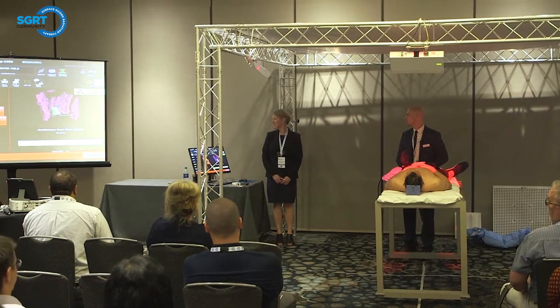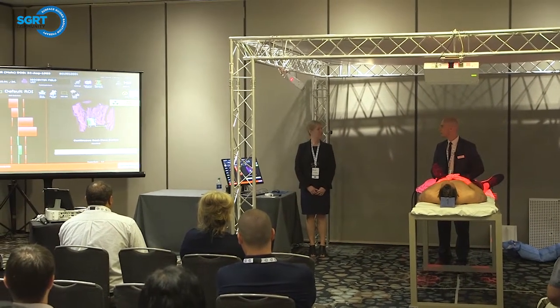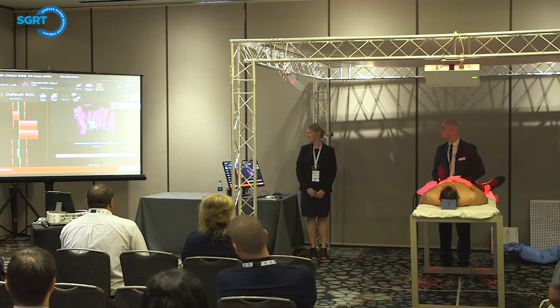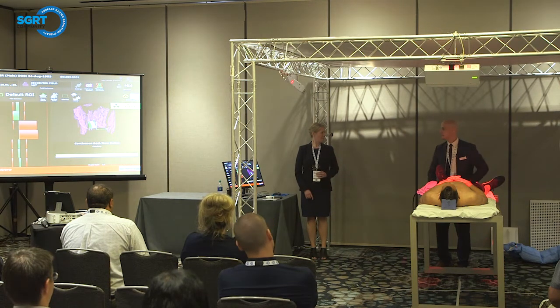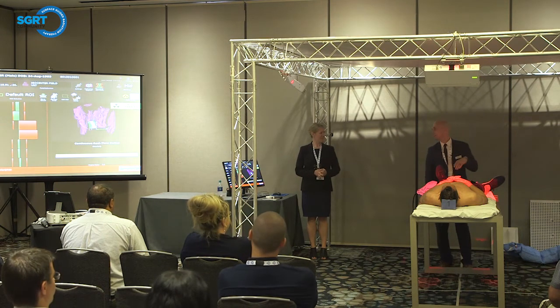Let's see, so I went the wrong way with the roll, so I'm going to rotate him out a little bit that way. Okay. Oh, come on. This is taking me too long here now. I got a little overzealous. Okay. Time? 32.49. 32, man, I'm getting slower. Okay, my record was 20 seconds.